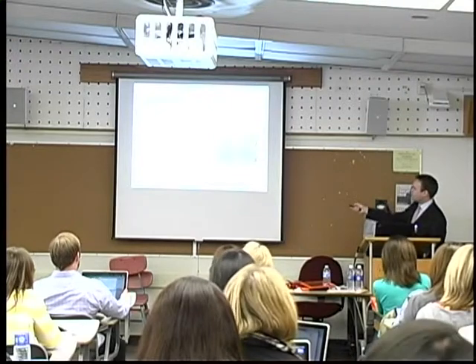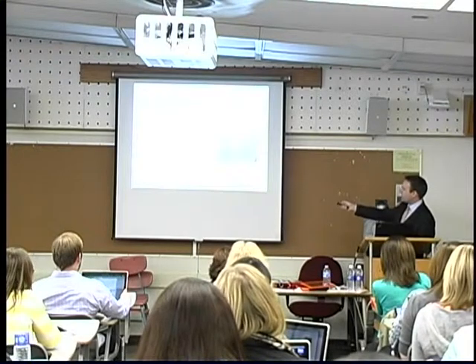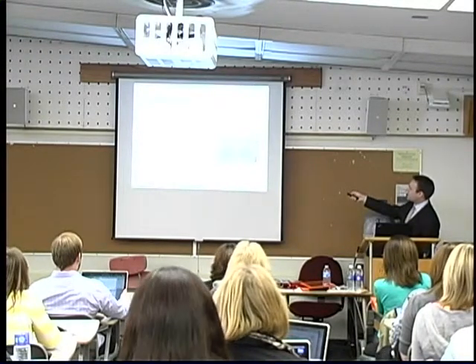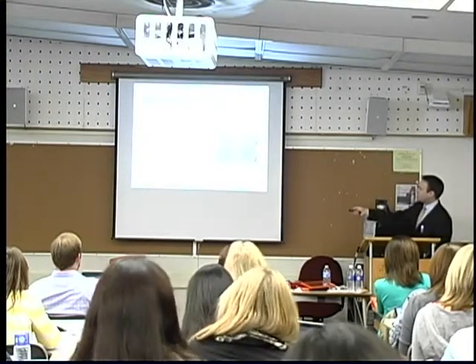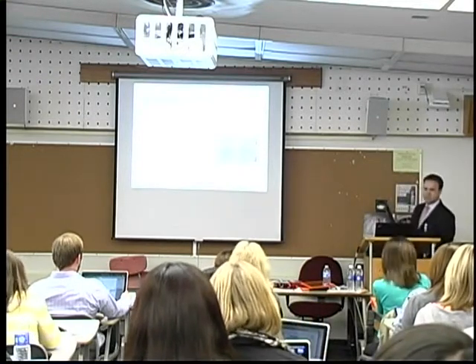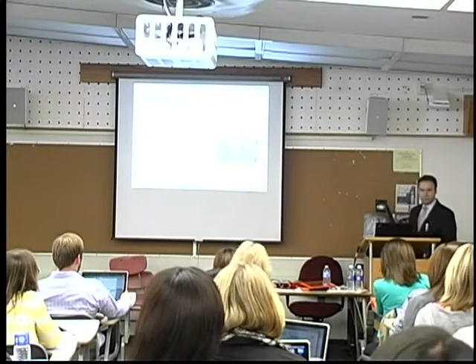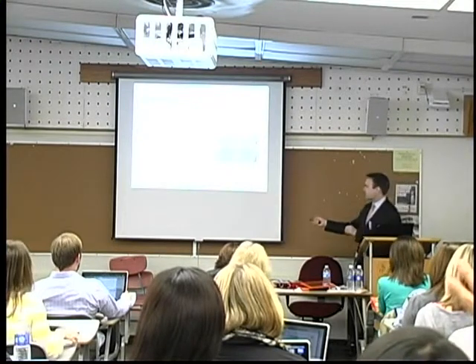So here I have such a visual scene display. There is the context of the town that I'm visiting, that I'm exploring as a tourist, in the background, and then I have things within that city, prominent sites and attractions, that I can then talk about. Right? And that could also be used in a dynamic display system, so I can put on different visual scenes for different contexts. For learners on the autism spectrum, particularly for those with severe autism, this, at least initially, may not be the ideal choice because of sensory processing difficulties.